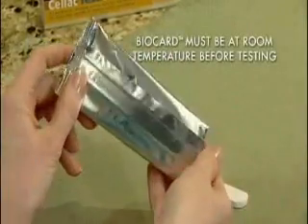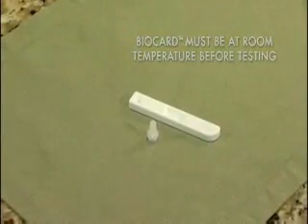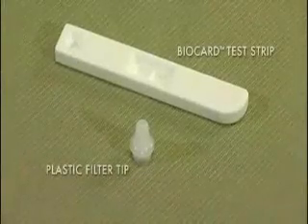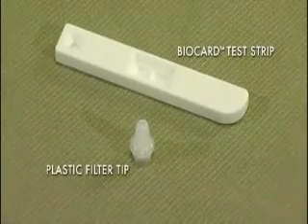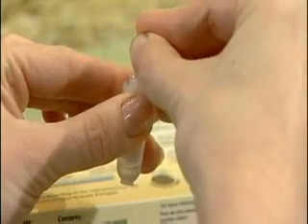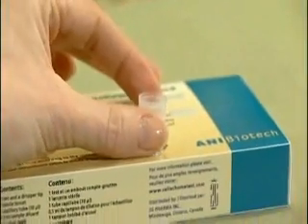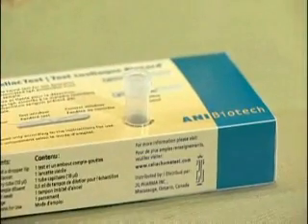Then, take the BioCard test strip and the replacement plastic filter tip out of the aluminum pouch. Place the BioCard test strip flat on a level, dry surface. Prepare the vial containing the buffer by removing and discarding the cap, and pushing the vial into the marked holder in the back of the outer box.